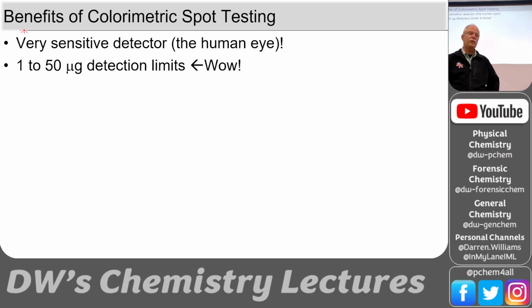This gets us down to 1 to 50 microgram detection limits, and that's good too, because even some of the more deadly analogs of fentanyl, I think carfentanil is one of the most deadly, where your lethal dose absorbed through the skin can be in the milligram ranges. So a milligram can be just a few little specks on the table. You wipe your fingers on the table and then you can't breathe, okay? Because fentanyl will specifically attack your lungs and your brainstem. It'll stop you from breathing. And so it'd be nice to be able to detect something way below the milligram range, and this can detect into the microgram range. So that's really nice.